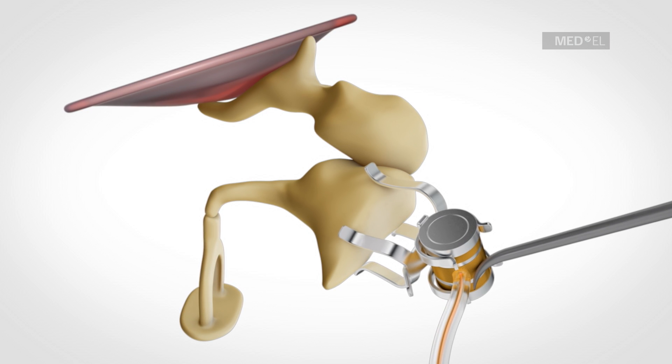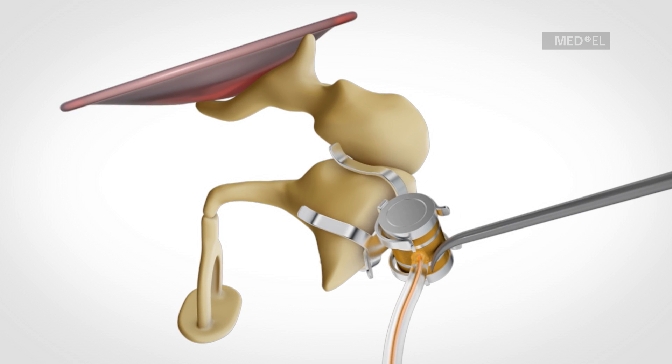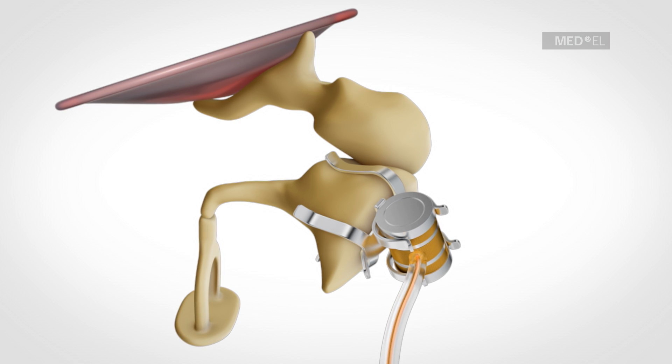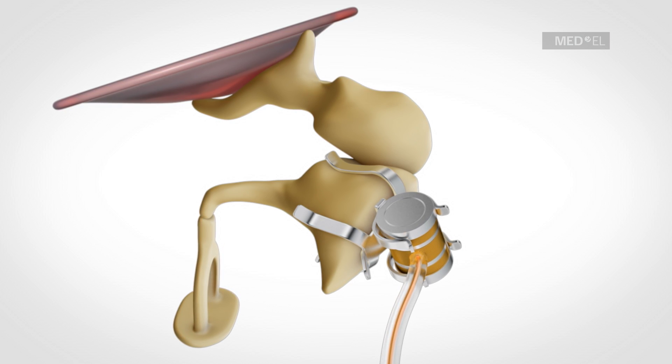The longer legs sit over the body of the INCUS and the shorter legs over the short process of the INCUS. Crimping is not needed and with this coupler there are fewer surgical steps.